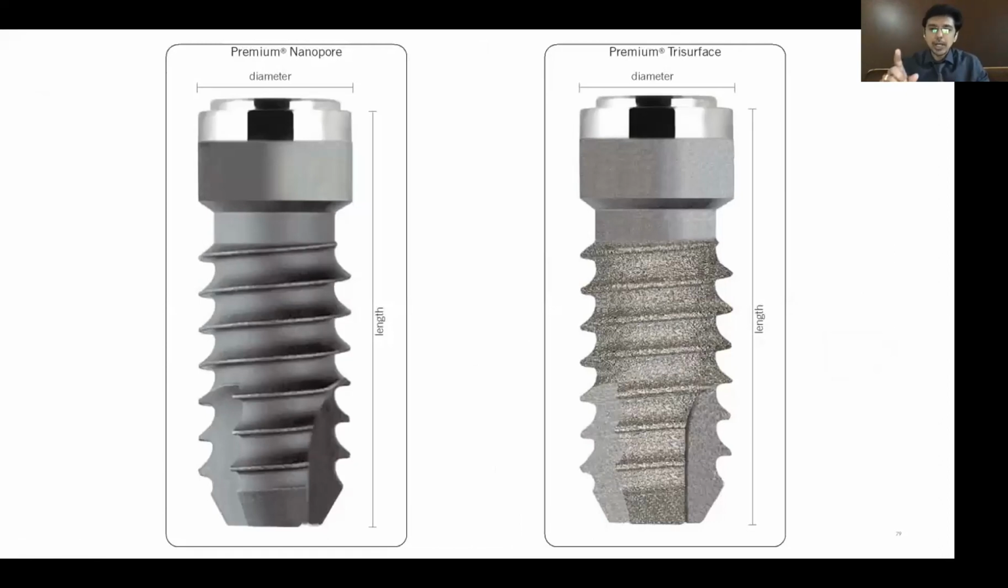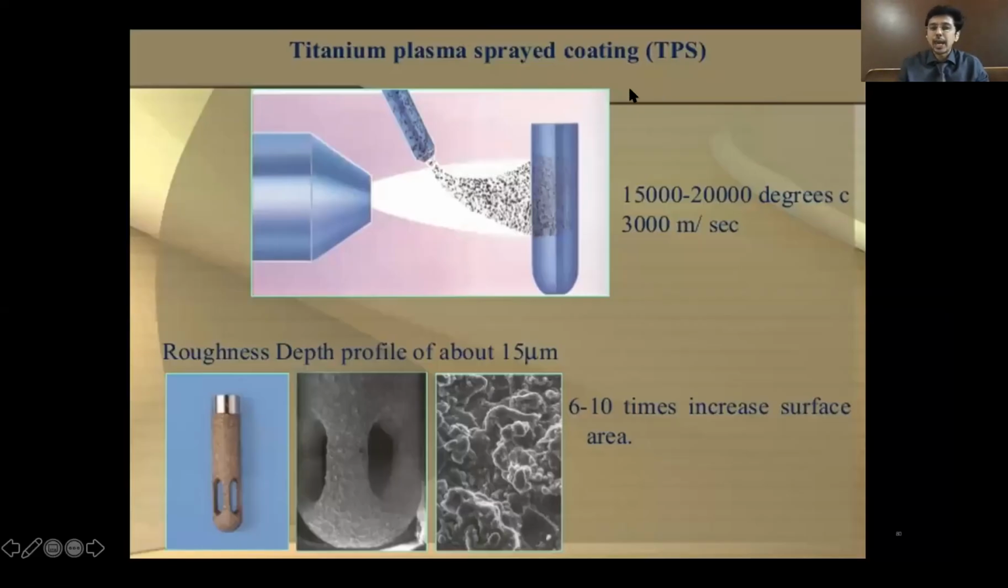In order to increase the roughness, during my PG time, 2002 to 2005, a lot of emphasis was on additive implant surfaces. This term was very, very popular. TPS, titanium plasma sprayed. Have you heard of titanium plasma sprayed?